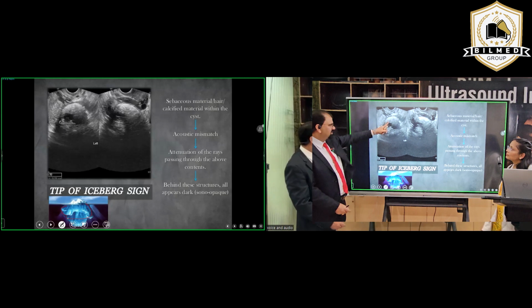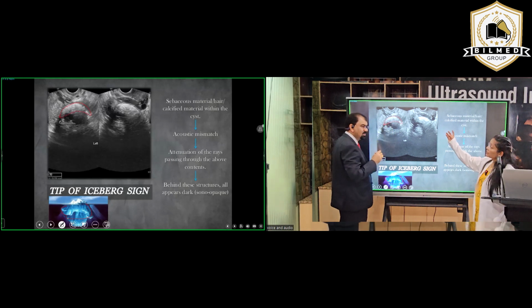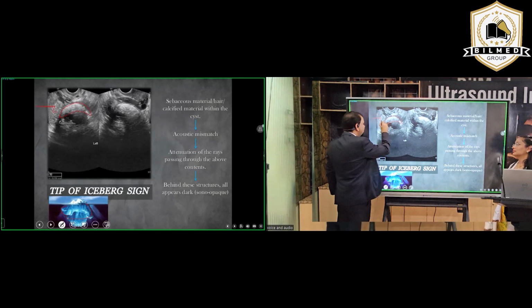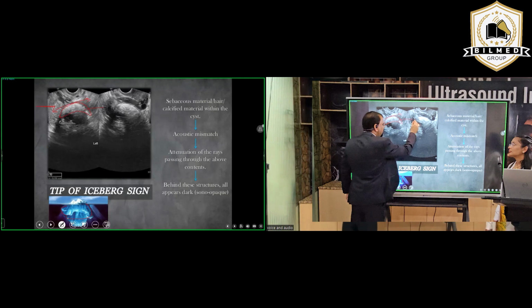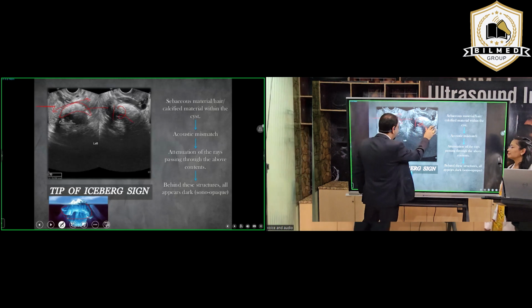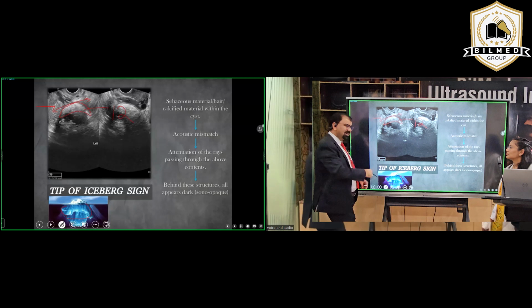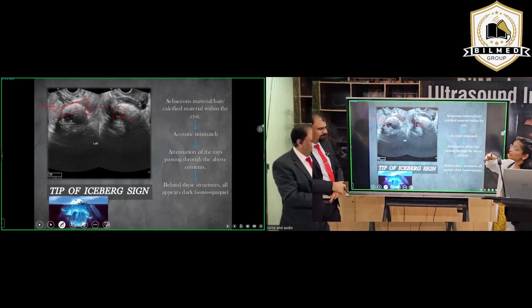On ultrasound, only a small echogenic thing will be seen. Now I measure from here to here, and it comes to maybe 12 centimeters. Let's take 12, a vague figure. Is this dermoid actually 12 centimeters? No, not at all, because so much echogenic material is down there.